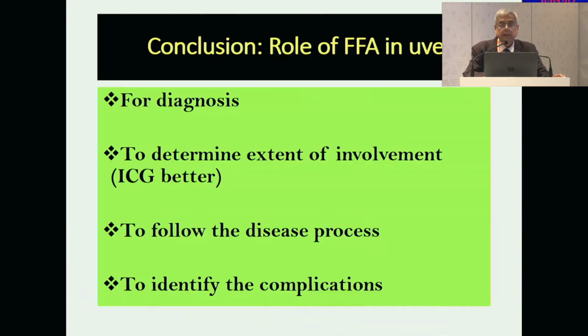So in summary, the FFA is required in several situations: for diagnosis, to differentiate between CSR and choroiditis, to determine the extent of involvement, to follow the disease process, and to identify complications.